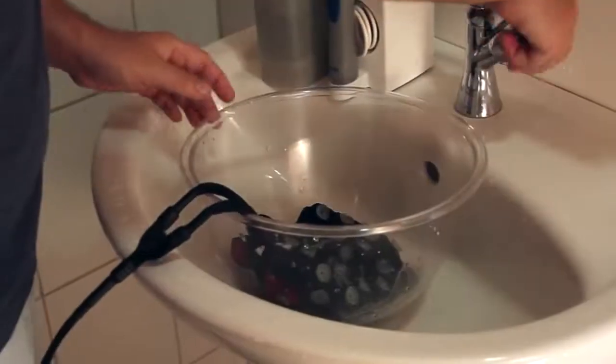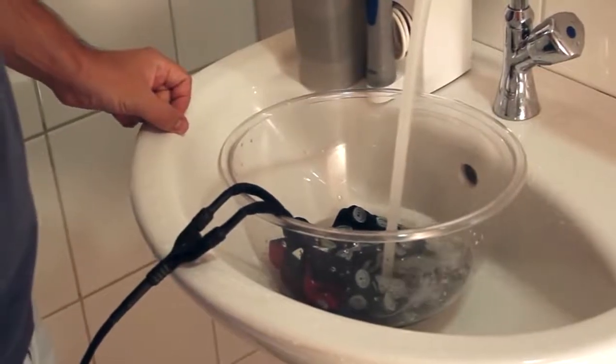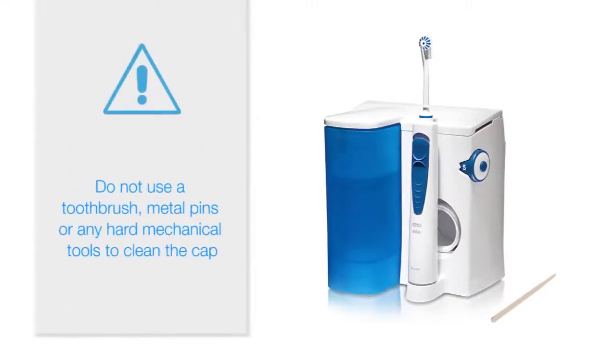If gel has dried in the cap, place the cap in a bowl of lukewarm water to soak for 5 minutes before cleaning. A water pick or wooden probe can be used to remove gel that is not loosened by soaking. Be careful to avoid damaging the electrodes.